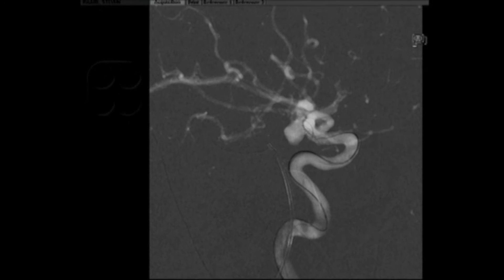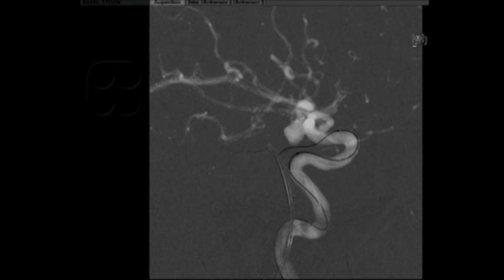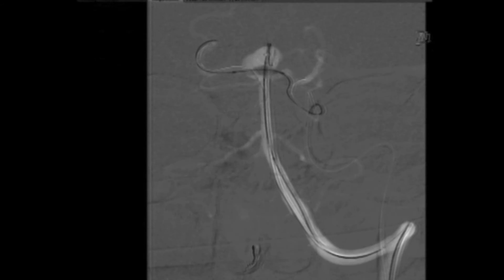We established another access — a secondary access through the left femoral artery. A 6-French Envoy catheter was advanced into the left internal carotid artery, and after demonstrating adequate caliber of the posterior communicating artery, we navigated a Hyperglide balloon from the left internal carotid artery through the left posterior communicating artery into the left P1-P2 segment, spanning the neck of the aneurysm and landing the balloon, covering the neck, into the right P1 segment.